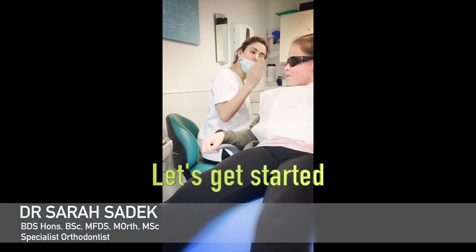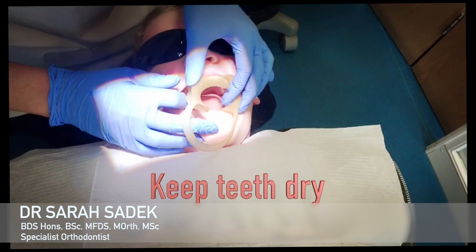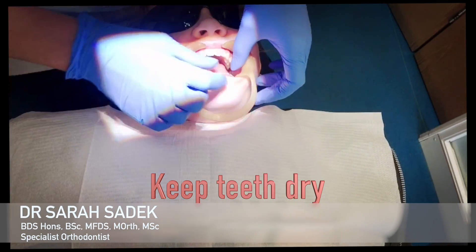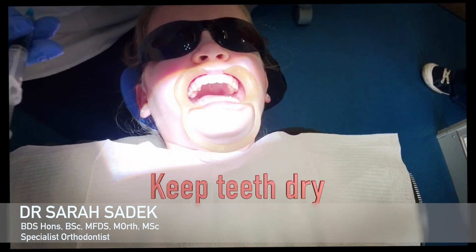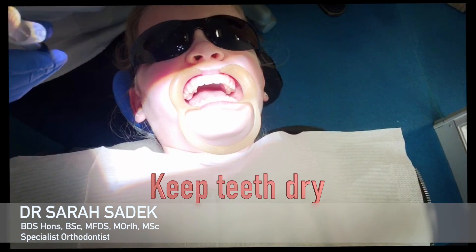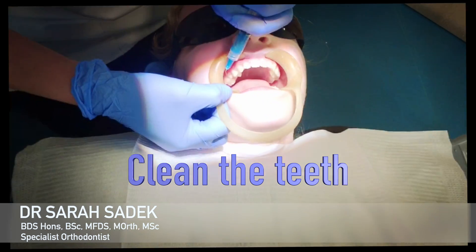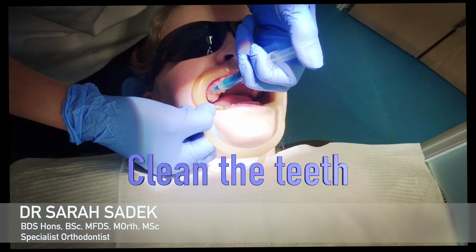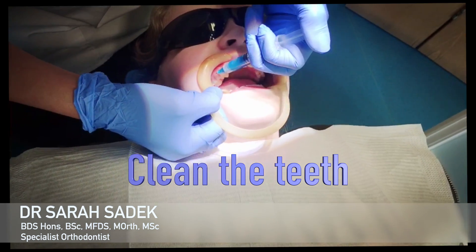Let's get started with putting the brace on. We start by isolating your cheeks from your teeth. This allows the area that we're working in to stay nice and dry. It's crucial that everything stays dry so that your brace can stick properly. We then paint your teeth in this blue liquid — this is not an injection, it just goes on your teeth and gets them really nice and clean.